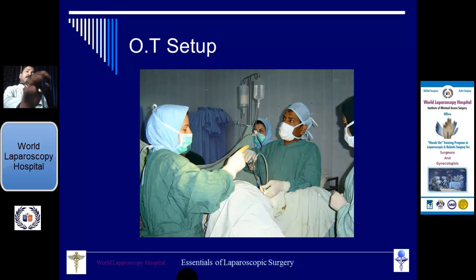If you put the laparoscope first, then it has a lot of advantages, like you can see the transillumination. And if you are doing a big procedure like metroplasty, septate uterus, big myoma, then in cases of any perforation also, it can help you to get the idea, and it can prevent a lot of injuries.